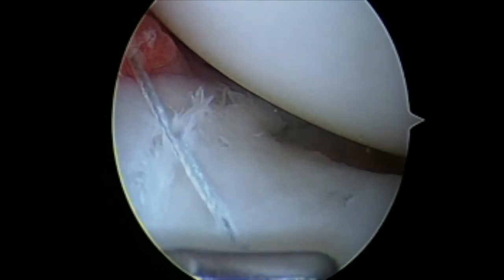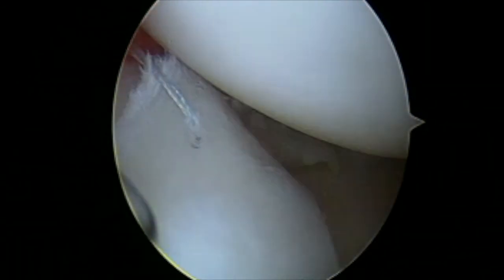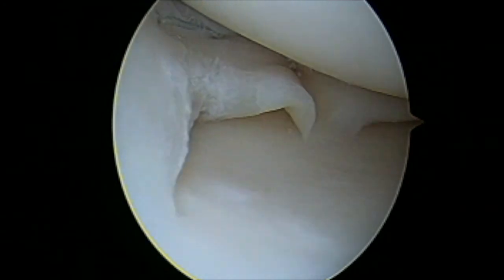Here I am probing the final repair and you can see it is a very robust repair. Then I will tie down the sutures outside the capsule.